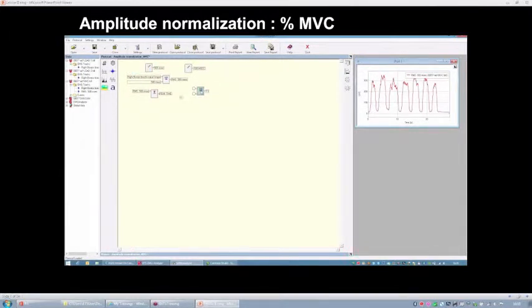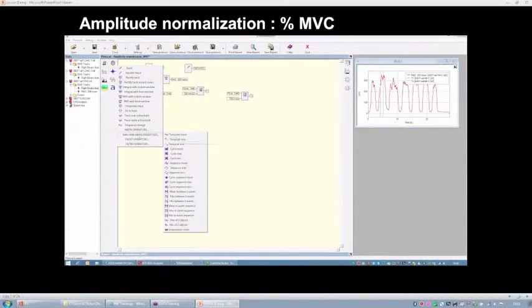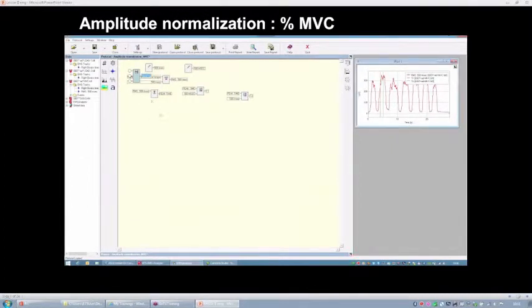Now I'm defining the two temporal events. The first is the peak time minus 500 milliseconds. And the second will be T2, the peak time value plus 500 milliseconds. So we are going to consider a period of 1 second around the position of the peak. And now I'm going to compute the average value in this period, using the mean value between two events.